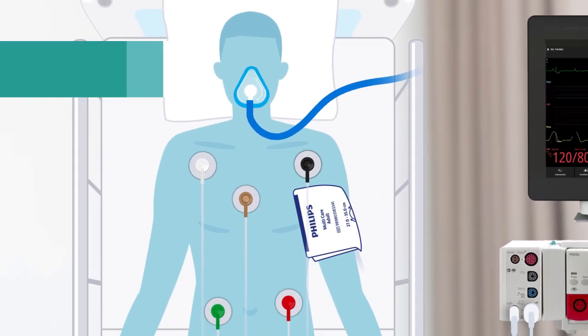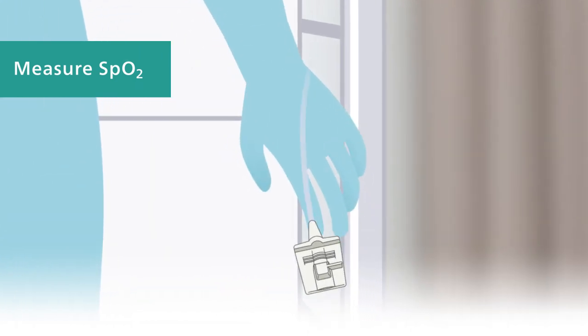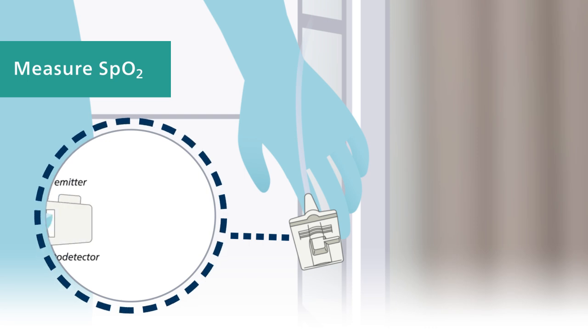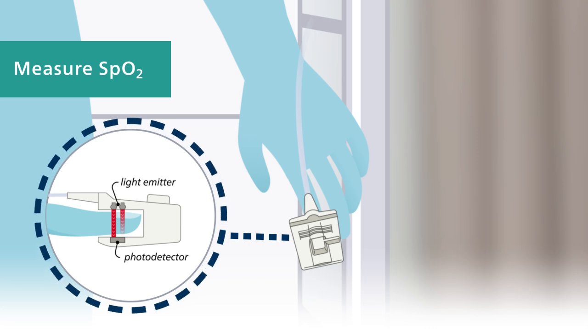To measure oxygen saturation, or SpO2, select a good extremity and consider the different sensor types. The application site should match the sensor size so that the sensor won't fall off or apply excessive pressure. Check that the light emitter and the photodetector are directly opposite each other, and ensure all light from the emitter passes through the patient's tissue.